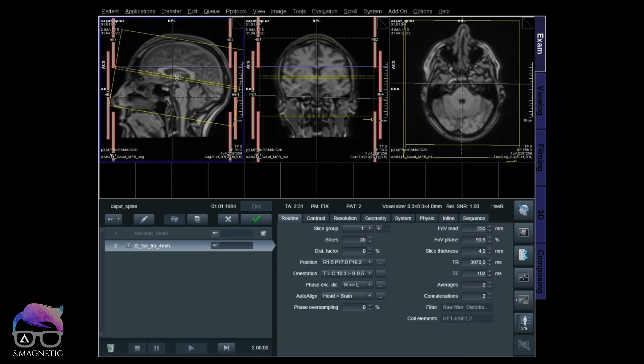The difference is that if you're using ISO, whenever you move your field of view, the blue line you see will move with your field of view. That means the table will move within your field of view - a little bit in and out. That's unnecessary because the head is a small area, so it's very local.